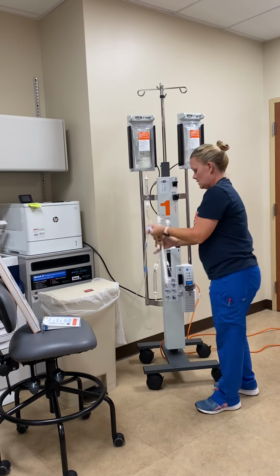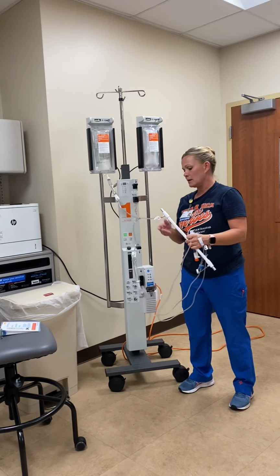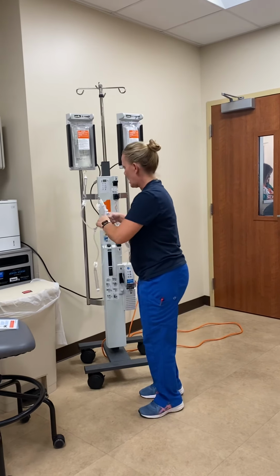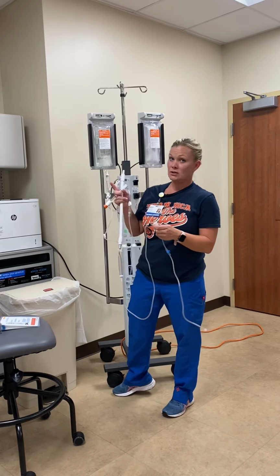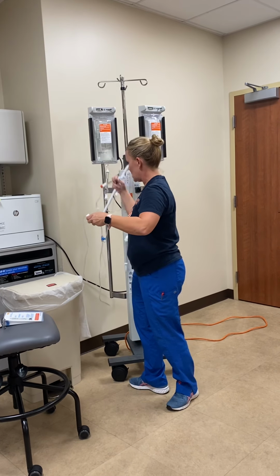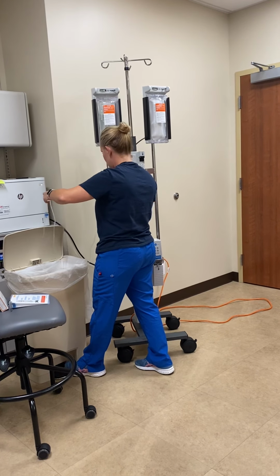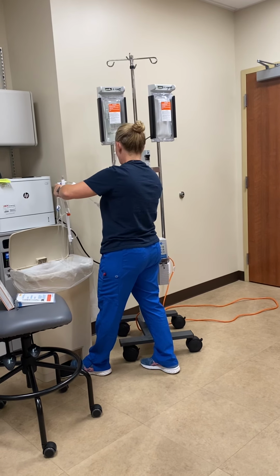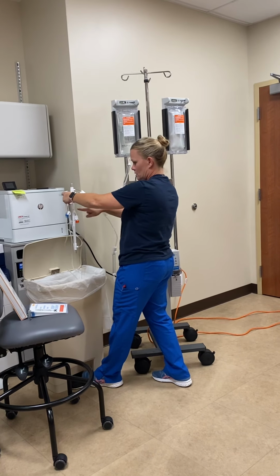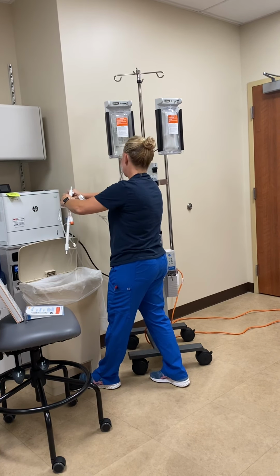Before I turn it on, like I said, I've already primed it. You've got so many clamps, right? Make sure all your clamps are open. After you get this, make sure at least one of your clamps is clamped. And then once you get this put in here, you can go ahead and open and let all your fluid run through. I'm gonna do that again just to show you how it works. So no bubbles. None of my chambers have bubbles. So that's sufficient.